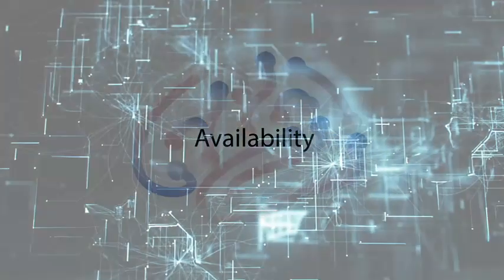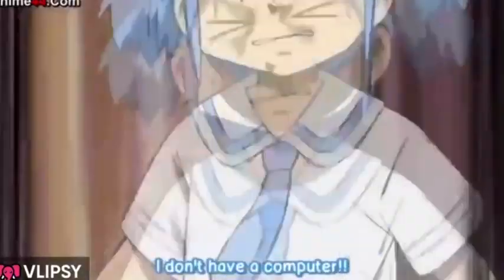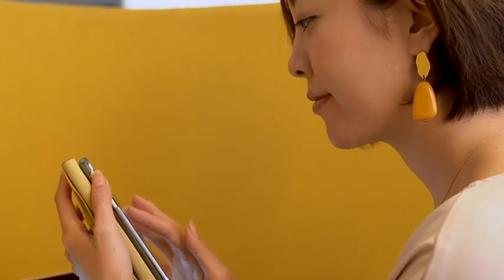Third, DSI Studio Cloud is portable across platforms and hardware, and we can initiate the computation from any device. You don't even need a computer to run DSI Studio Cloud. A cell phone is enough for tractography analysis.